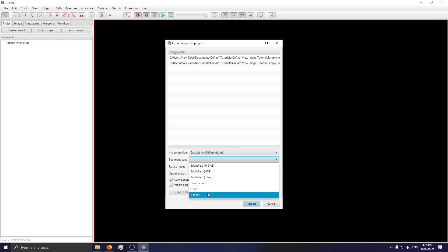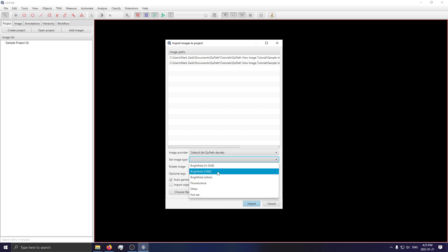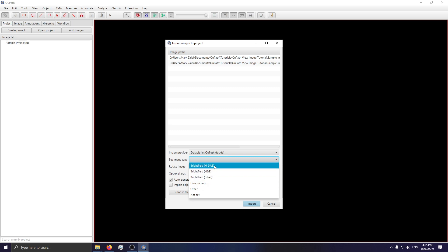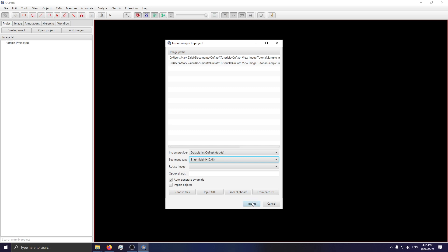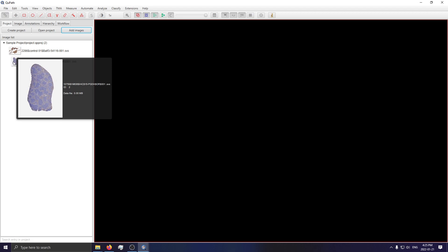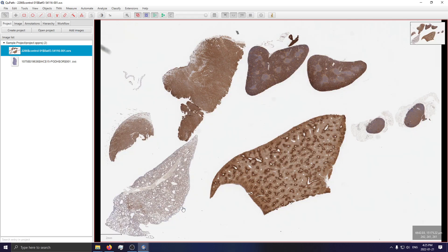In this case, the images we have are DAB staining, so I'll click "Brightfield H DAB." Then we click Import. Give it a second to load the images in — now they're loaded. You can see a nice little thumbnail of each for a quick preview. Let's go ahead and load the first image.